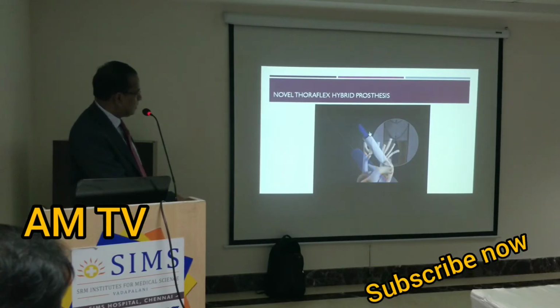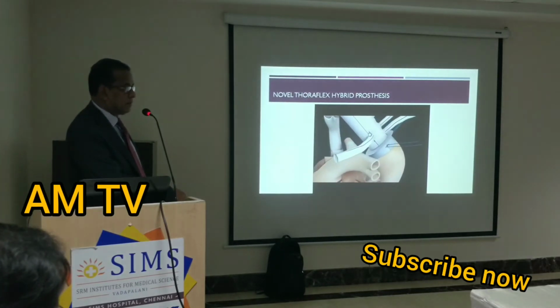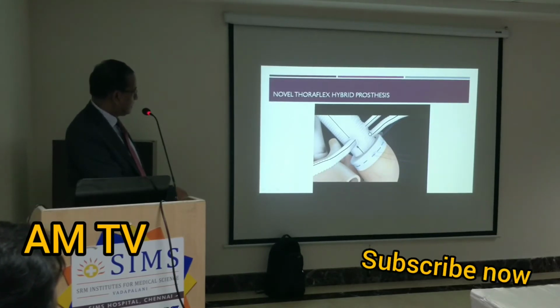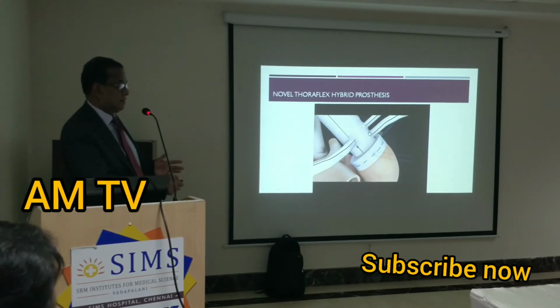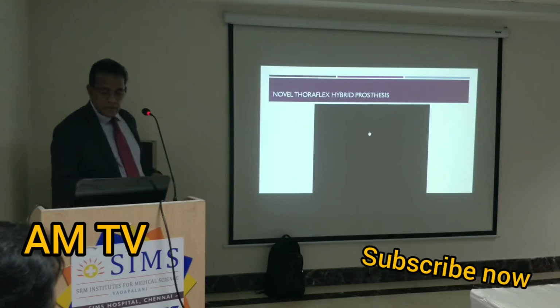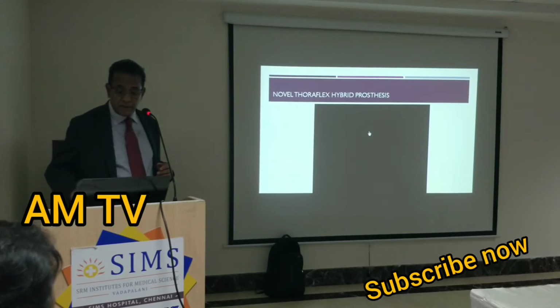It's just an animation, it looks very simple here, but it is not that easy when the heart is arrested and we have to keep the timing. We cannot have too much time to do the operation. One of the problems in an acute emergency is these tissues are all very weak. It will not hold the stitches. All these areas can leak and you may require a lot of blood. Sometimes it will be very hard to stop the bleeding. One of the complications of this operation is uncontrollable bleeding when the tissues are very weak.